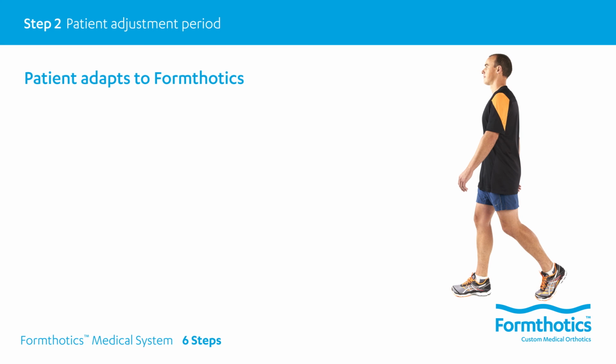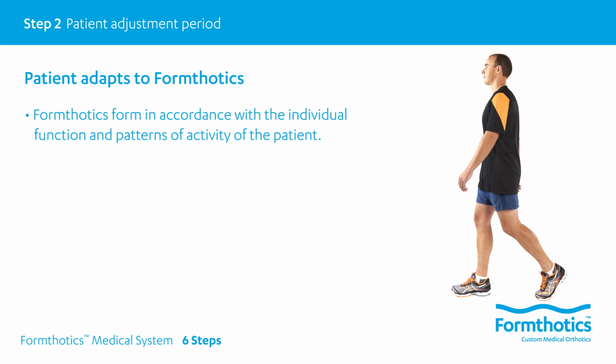The break-in period is really important because the feet and legs need time to adapt to the new position the Formthotics are holding them in. If too much is changed too soon, the patient will take longer to adapt and may experience new pain that could have been easily avoided.